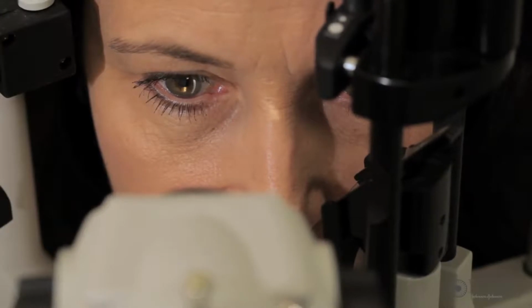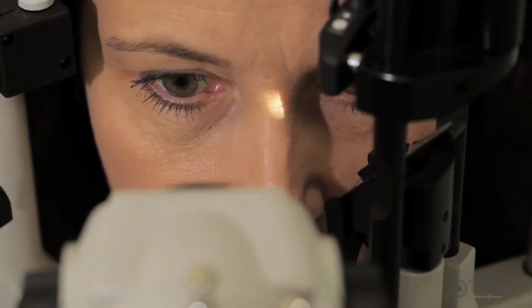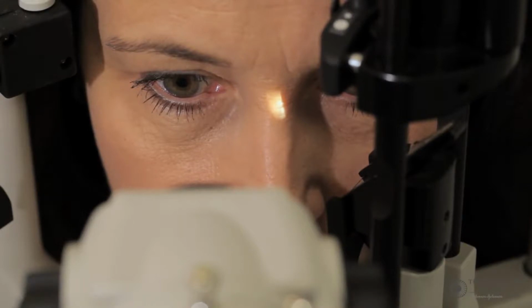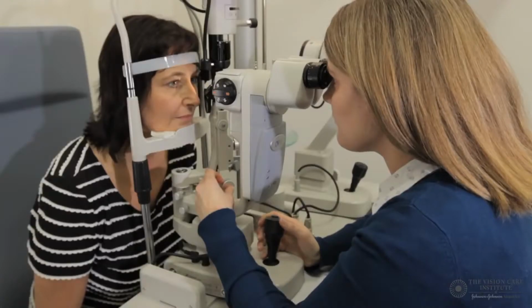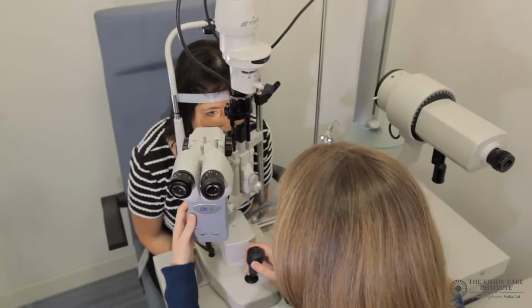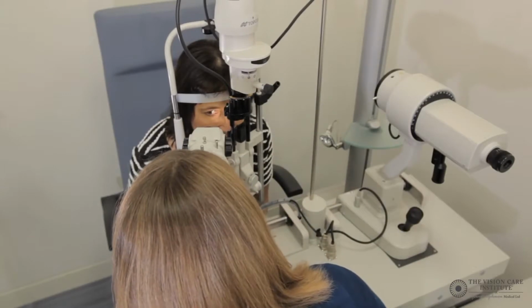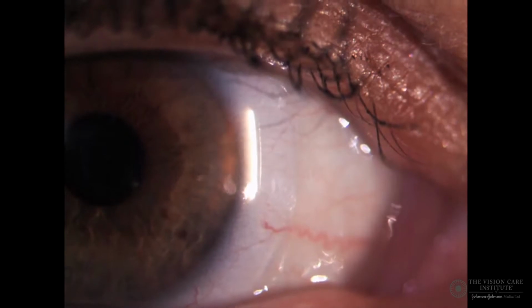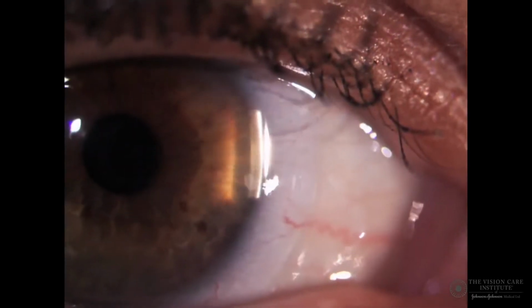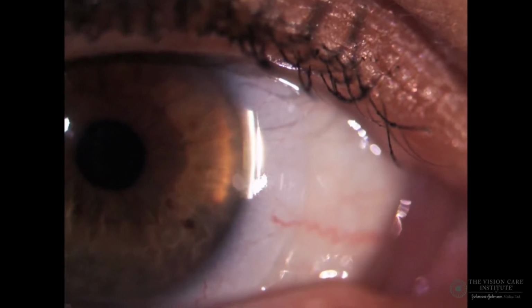In most patients, when we attempt to form a section at the very edge of the cornea, what typically happens is that the nose will get in the way of the illumination system, as shown here. As a result of this, the section cannot be formed while the patient is looking straight ahead and having an angle of 60 degrees. In order to overcome this, we need to move the whole of the observation and illumination system together, as shown here, by about 5 or 10 degrees, and ask the patient to direct their gaze directly into the microscope objective. When we do this, the section can be formed on the very nasal side of the limbus, as is being shown here.